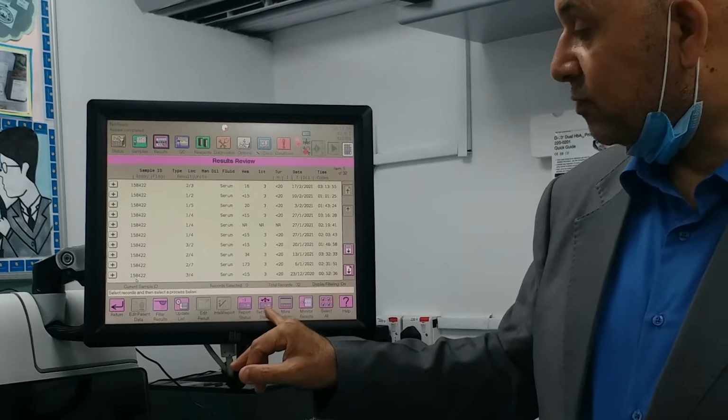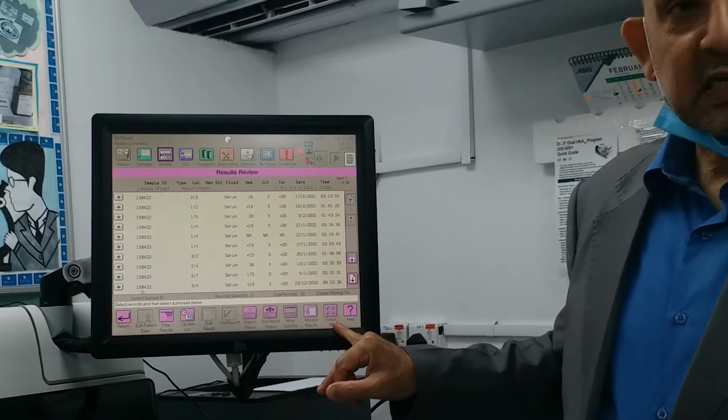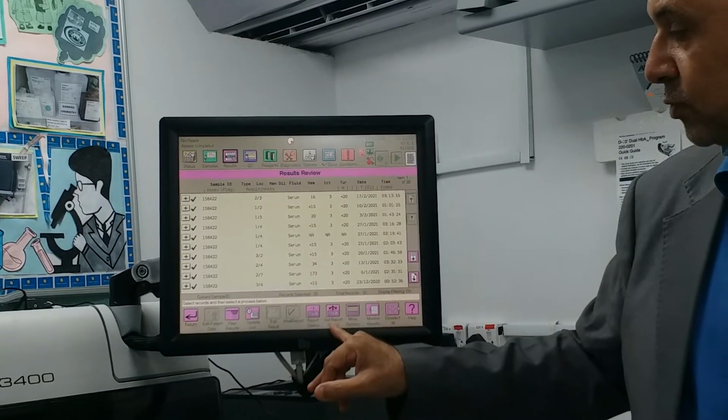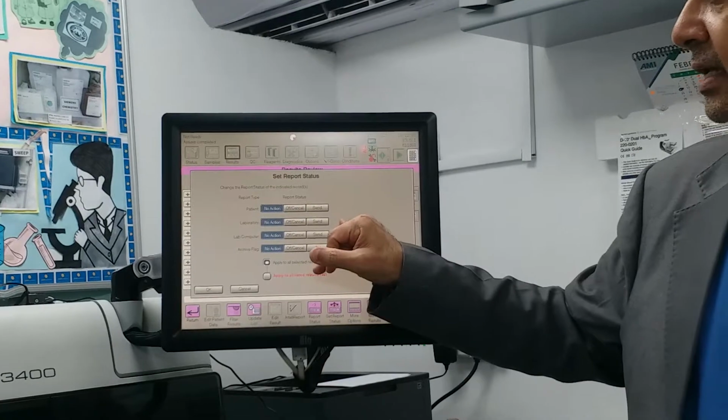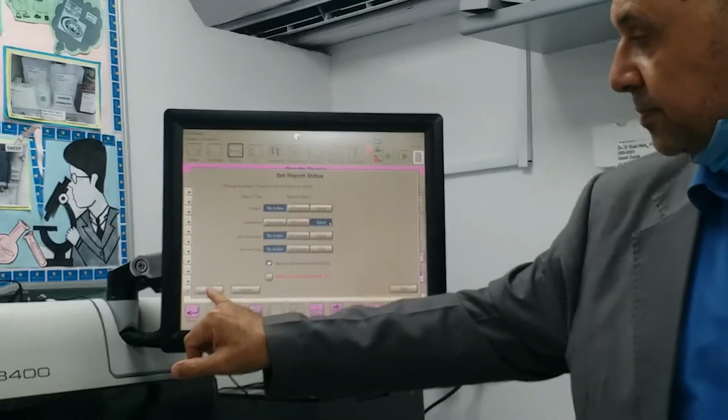Now I have to go here. I have to check and select it all. Then I set the report in the laboratory form and send. Then I say okay.